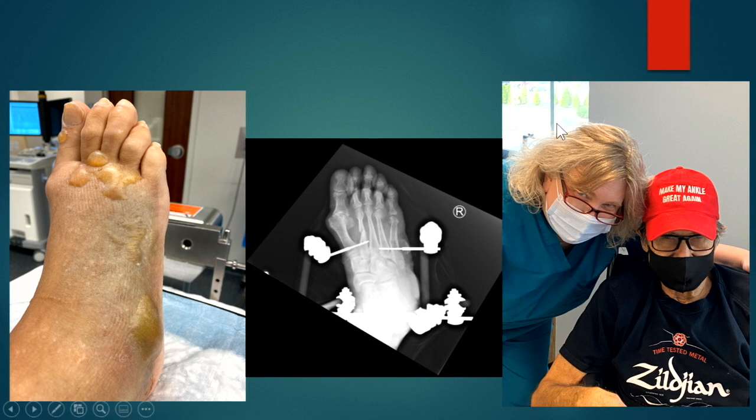And so in an effort to get him stabilized, initially, I provided him a frame like this, attached to the frame that spanned his ankle as well. But the ankle skin improved, and I was able to go ahead and fix the ankle internally, and that was good because it needed it. The foot may not be perfect, but for this guy, it's great. He is running around the town of Cape May Courthouse, my new home away from home, and he is very, very comfortable.